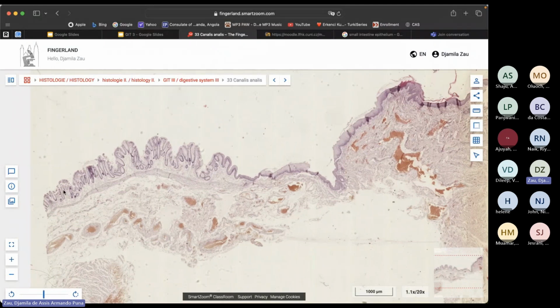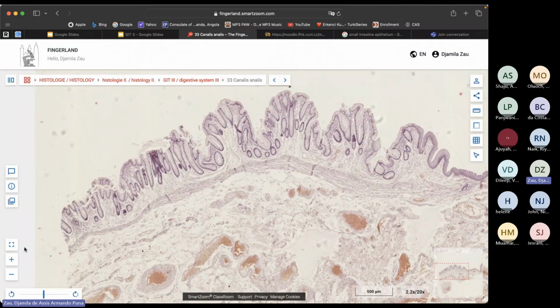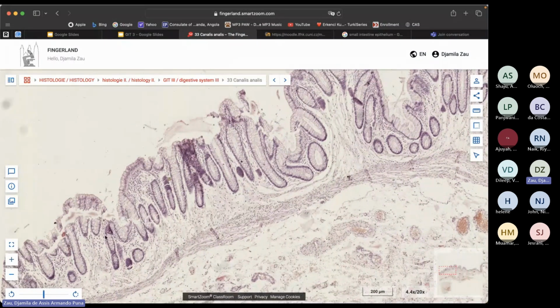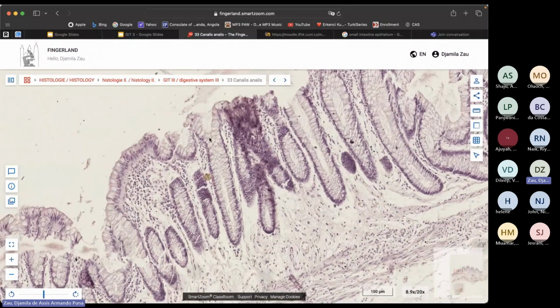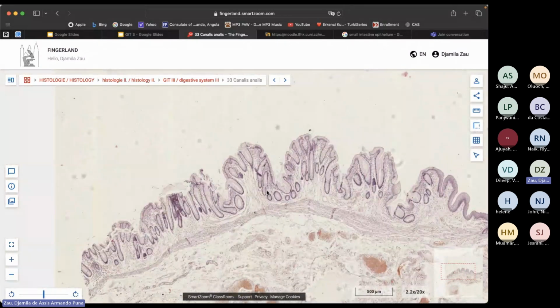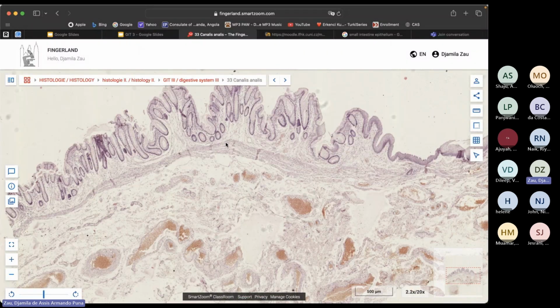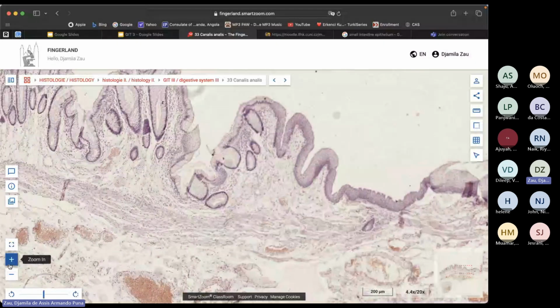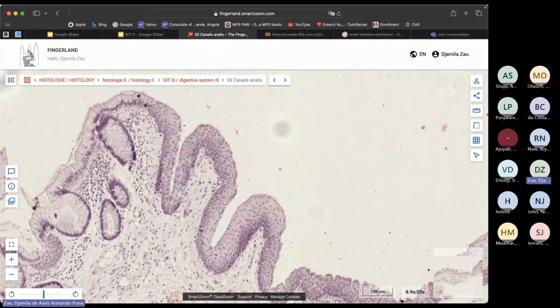So I'm going to start here, the outermost part. This is clearly the columnar zone, guys. I just need to zoom in, and it's no different than what we have been seeing before. Look at the simple columnar epithelium, look at the goblet cells, look at the crypt of Lieberkühn. This is the columnar zone of your anal canal, and then boom, there's a sudden change, literally a sudden change from columnar to stratified squamous, non-keratinized.